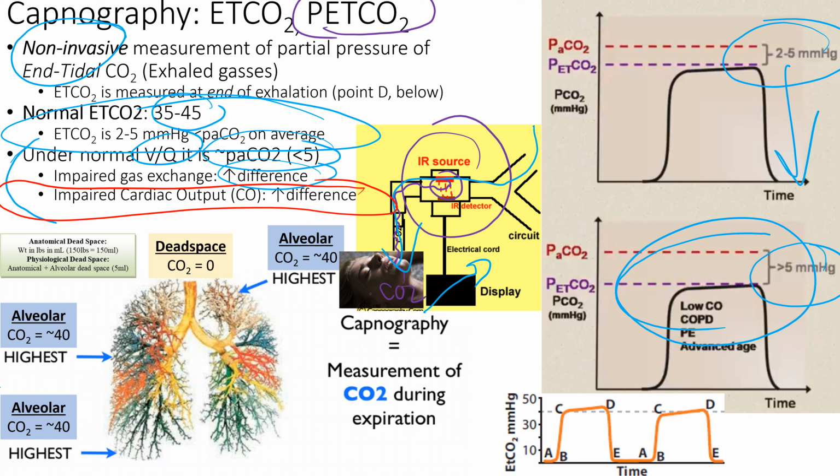We talked about the SpO2 being a poor man's A line. End-tidal CO2 is also like a poor man's A line. You can't really get information about the vasculature, but you get information about a drop in blood pressure immediately, right? Not everybody has an A line, but everybody has an end-tidal CO2. They should, right?